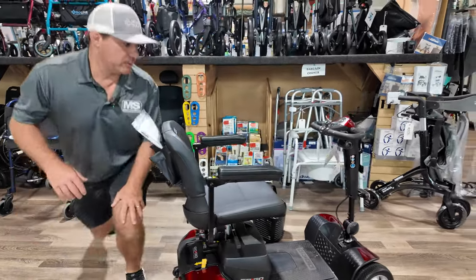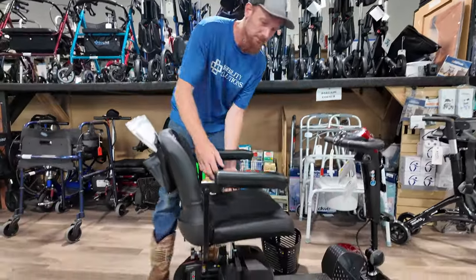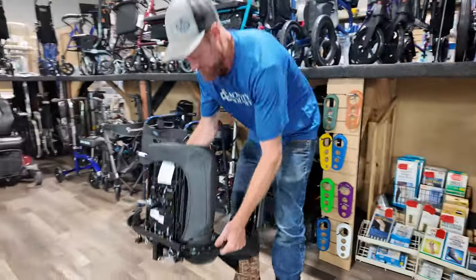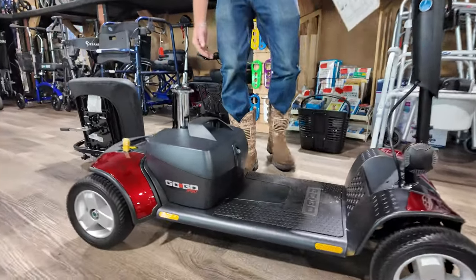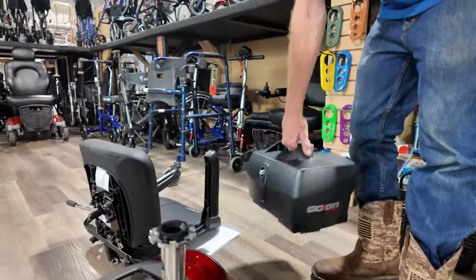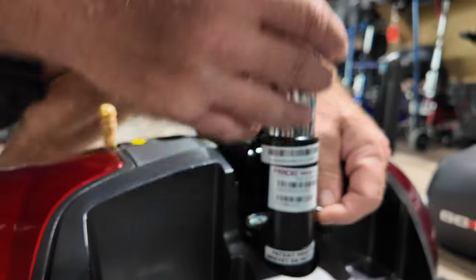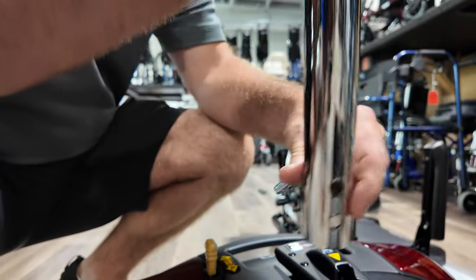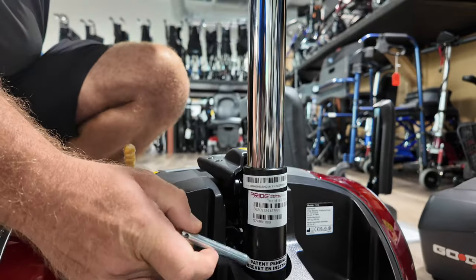I'm going to show you how it comes apart and bring Josh in. Josh is new with us. He's going to take the seat off — we already removed the basket. So the seat comes right off. The battery pack will come right up. Now this battery pack is going to be a little bit heavier, it's about 30 pounds. One thing I didn't point out: most units you get will have an adjustable seat. With the GoGo, the pin can come out and be removed, and then you can adjust the seat height or store it better. Adjustable seat height very quickly, no tools required.